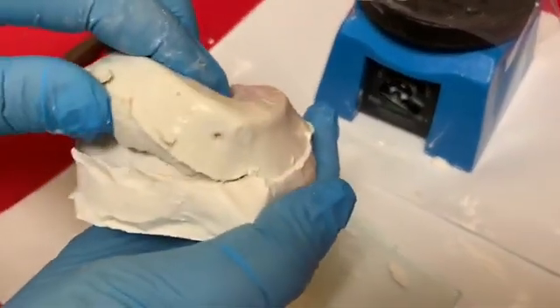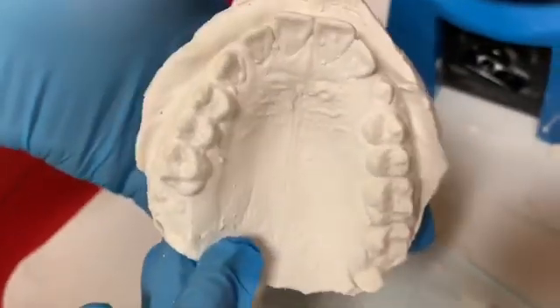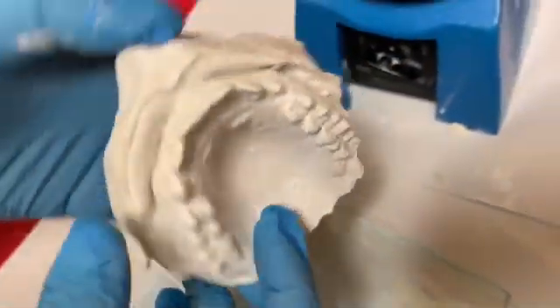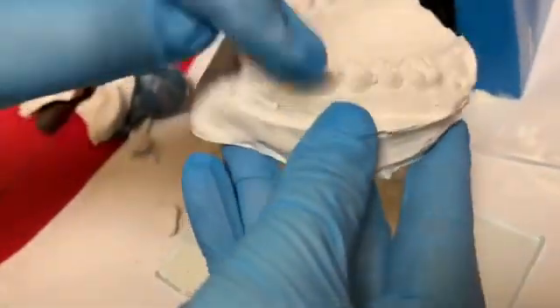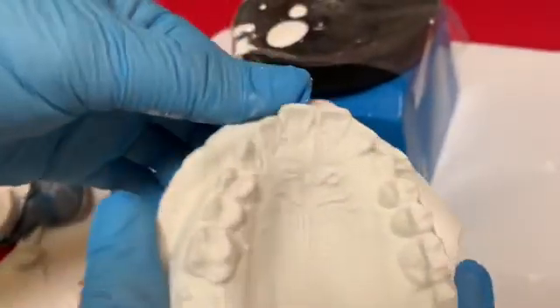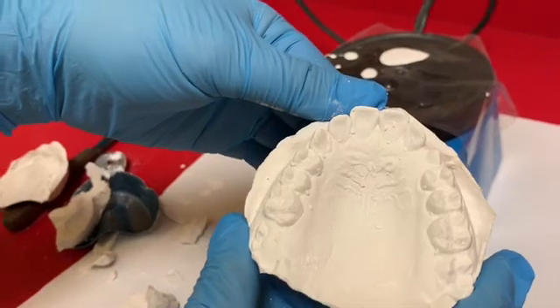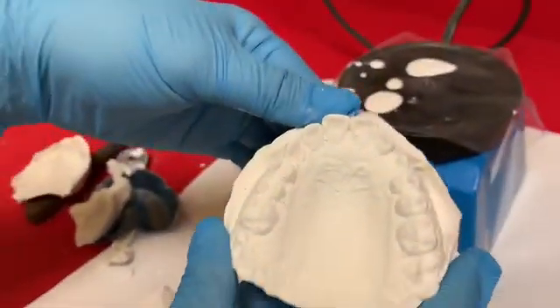Voilà! Here it is — Nicholas, you did such a great job pouring it up. You can see all the teeth clearly. We'll probably trim back a little bit of the plaster so they can get a really good seal for the sports guard. It'll take a week or so to get it back from the lab, but we'll check back in so everyone can see the final product. Thank you Nicholas for all your help — love you!